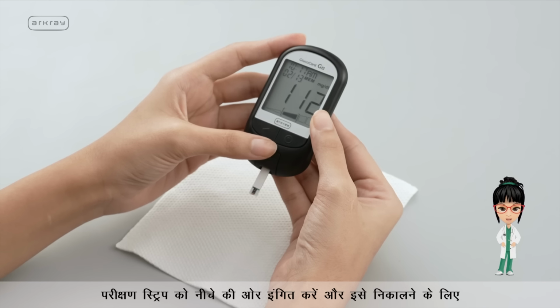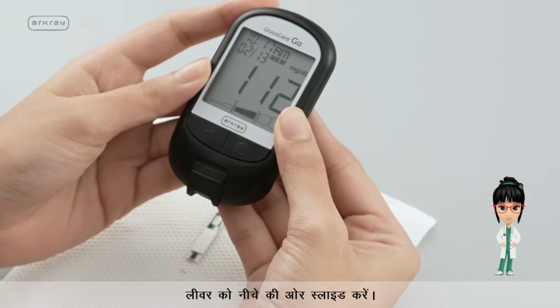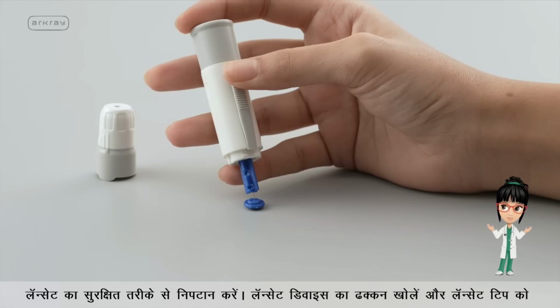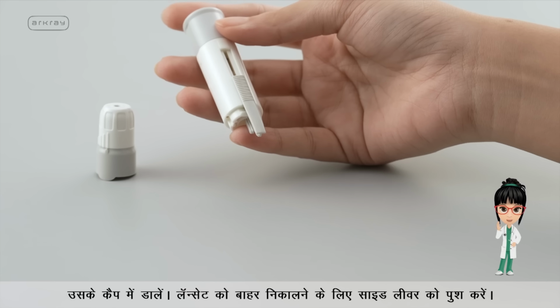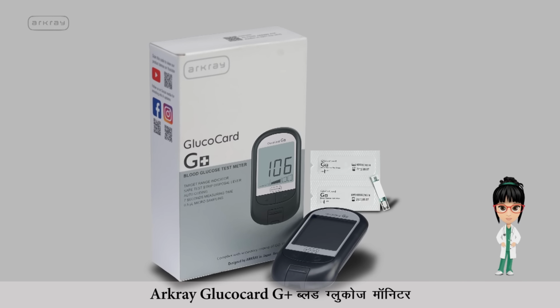Point the test strip down and slide the test strip disposal lever on the device to eject it. Open the lancet device lid and insert the lancet tip into its cap. Push the side lever to eject out the lancet. Arkray Glucocard G Plus blood glucose meter.